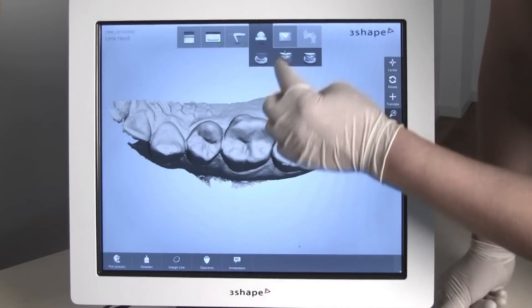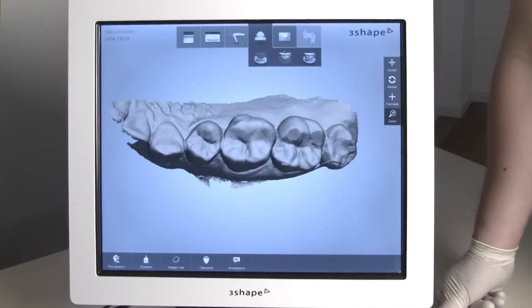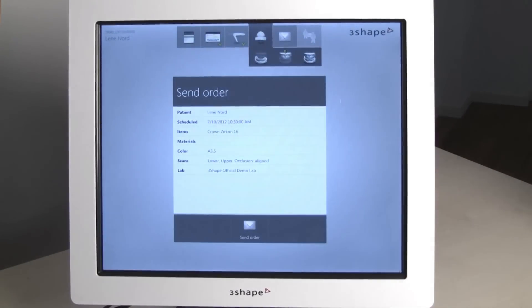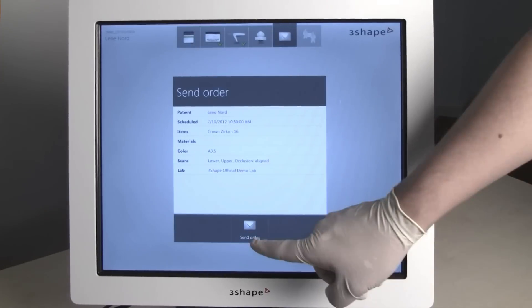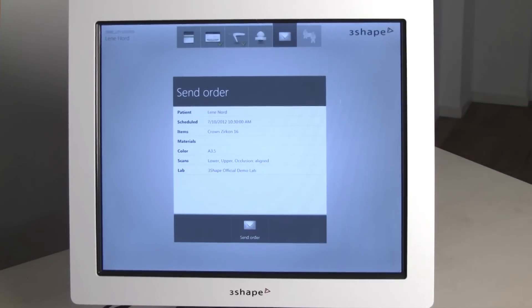Go to the send page. Here you can view a brief summary of the completed order. Press send to dispatch the order to the lab.